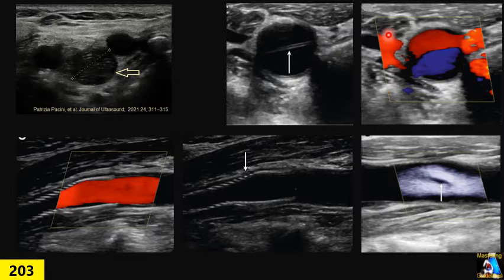And finally, if we put color on, we can see a double lumen or duct that is typical of dissection. In any other situation, we will not have those characteristics, and so it will be artifact. So you have to be aware and change insonation direction, orientation, short axis, long axis, and finally with color we can prove if there is any dissection or not.